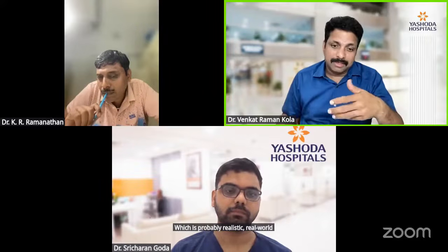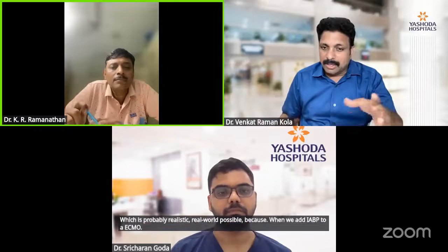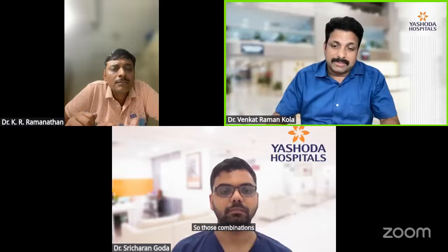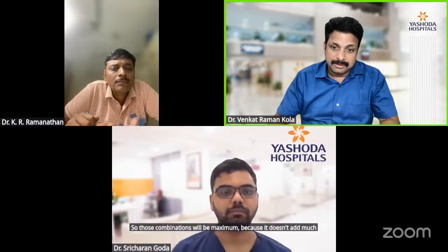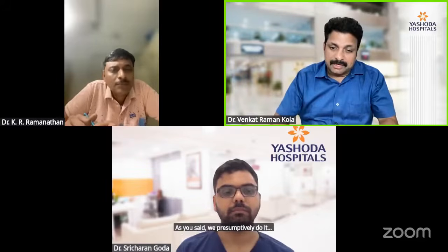Which is probably realistic and real-world possible, because when we add IABP to an ECMO, in the Indian or Asian context, the possibility of acceptance of that combination will be maximum because it doesn't add much to the cost. As you said, we presumptively use IABP at the start of a VA ECMO. So that's your first choice. Yes.